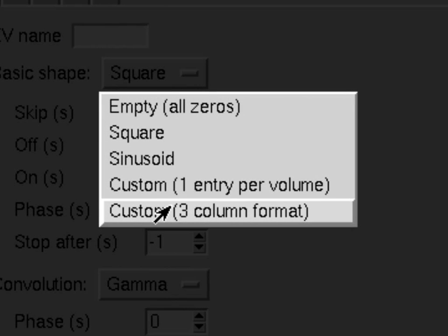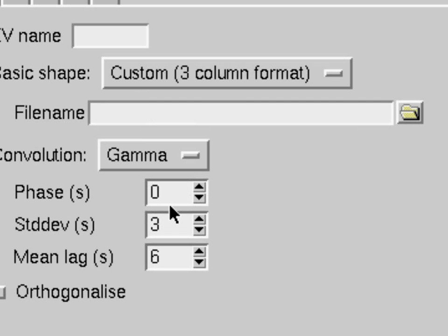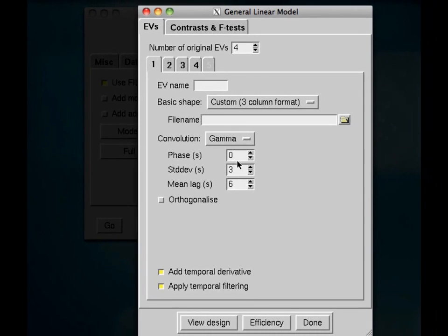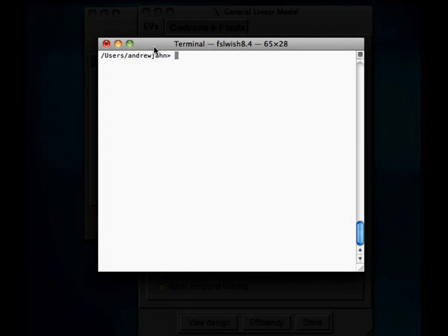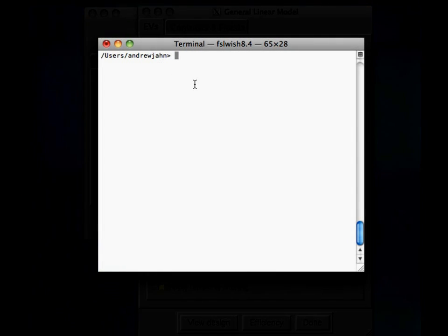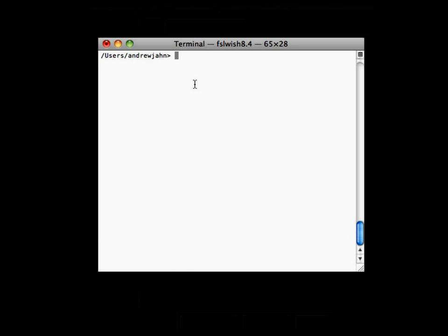So we're going to go ahead and select that. Now, I'm going to show you really quick what a typical timing file should look like if we're going to be using the custom three-column format. In this data set that is available for download on the website, I give you eight different text files because there are four conditions and two runs. Four conditions per run, two runs, eight text files.